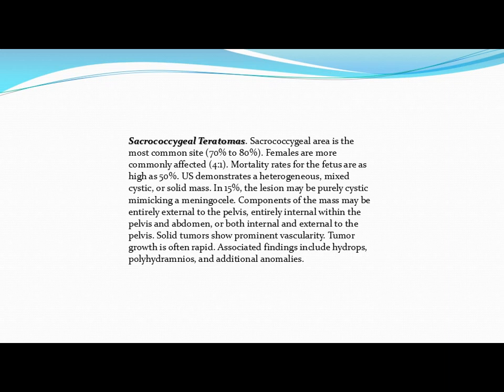Sacrococcygeal teratoma is very common. It can be external, internal, or mixed. It can happen at any stage of the pregnancy. If you see it, it might enlarge rapidly, might cause difficulties in the delivery, might change it to cesarean and things like that. You should keep that in mind.